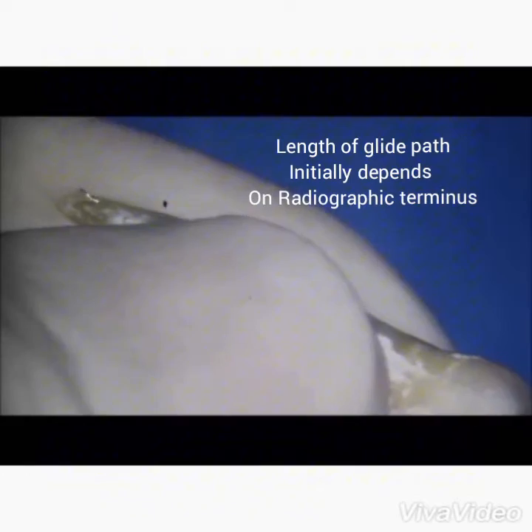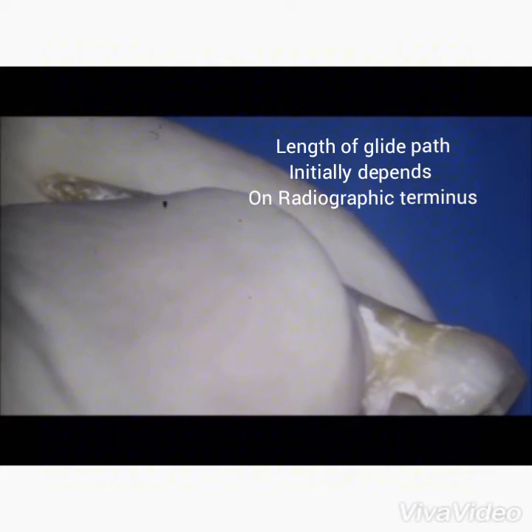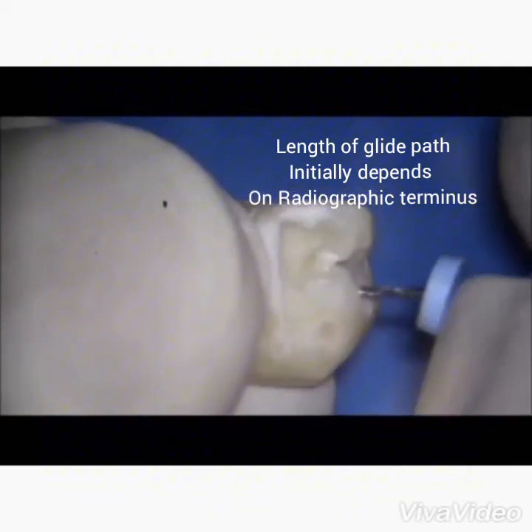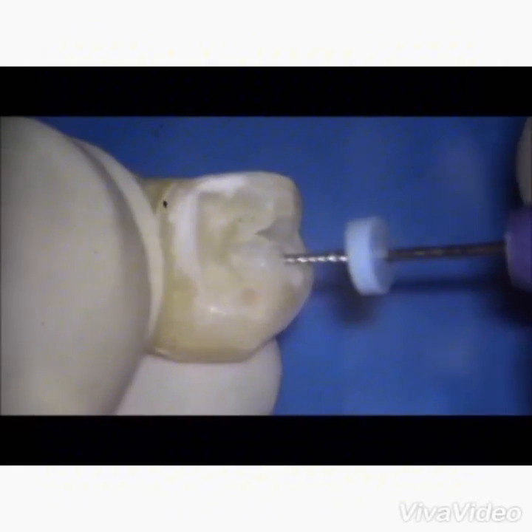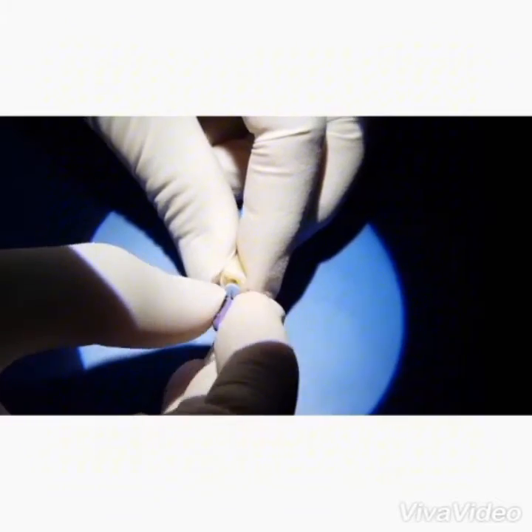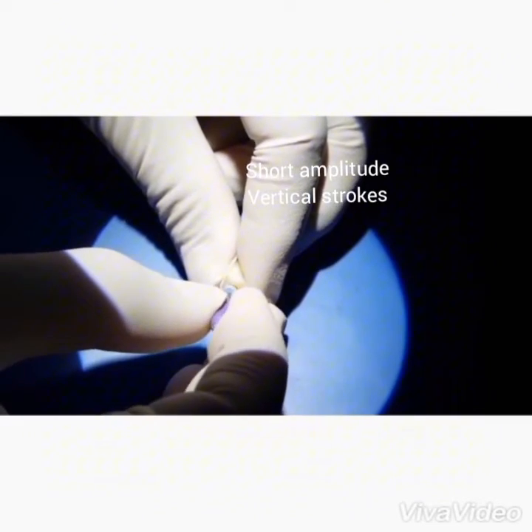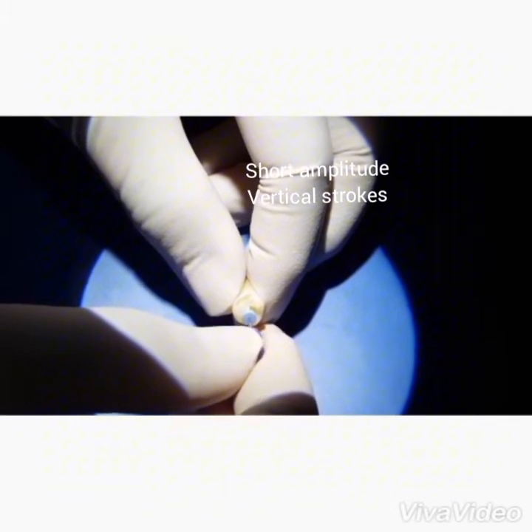As you follow the canal, you will feel the file slip, slide, stroke, and trail through the walls of the canal. Once the file has reached the radiographic terminus, use short, smooth vertical strokes to eliminate or remove the restrictive dentine.